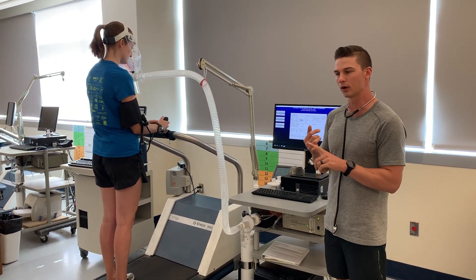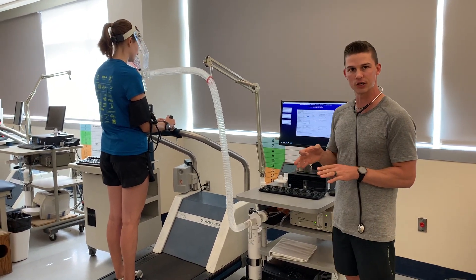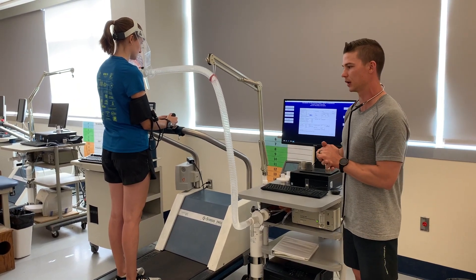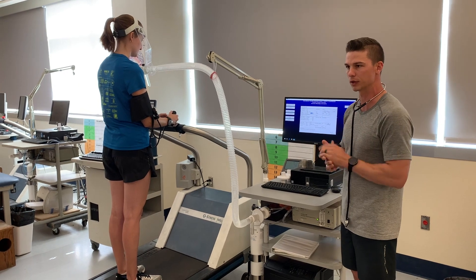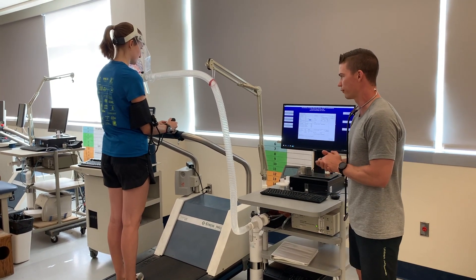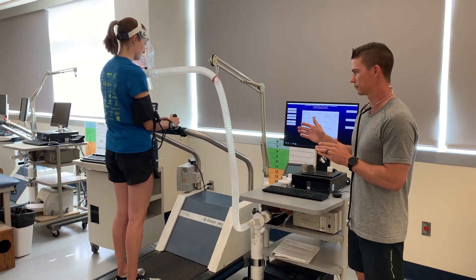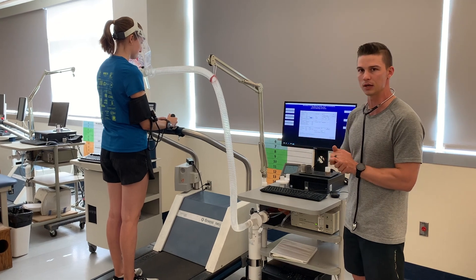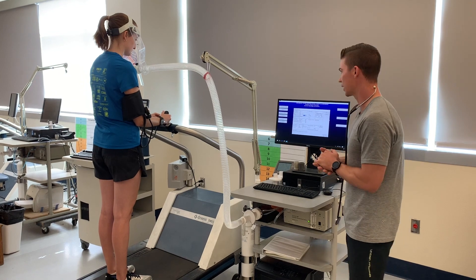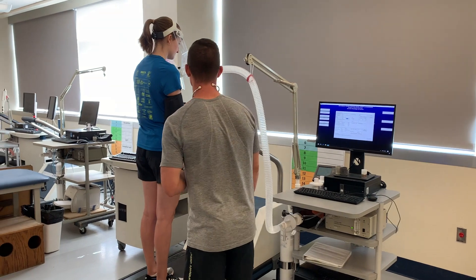We are going to record her heart rate, blood pressure, and RPE for each stage of the BRUCE protocol. The BRUCE protocol has three-minute stages and we go up sequentially in grade and speed for each stage. For each of the stages we record blood pressure, heart rate, and RPE within the last 15 seconds of each stage. I'm going to get Betsy started here and then we'll walk through the measurements after we get started.